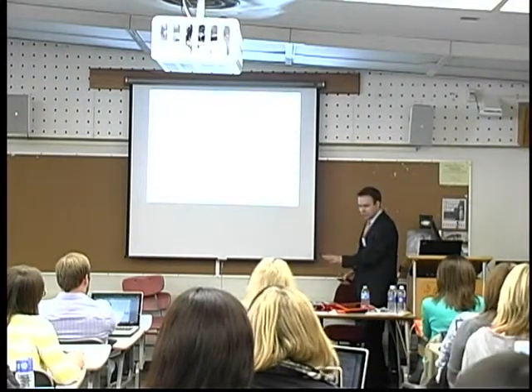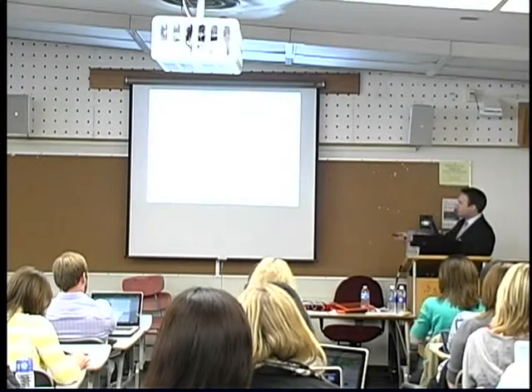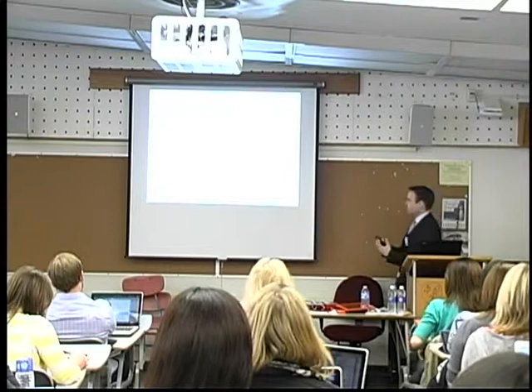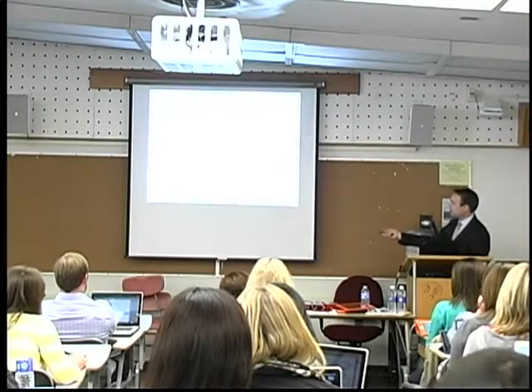The individual is selecting the graphic symbol, the device speaks it out, and that might facilitate language comprehension. Producing speech can be perceived as more natural than using manual signs or just pointing to a communication board. It can increase intelligibility, and it's easier to get attention.